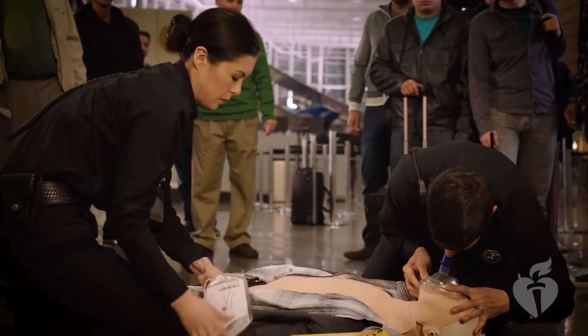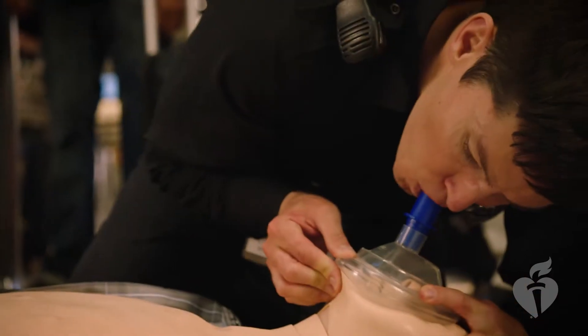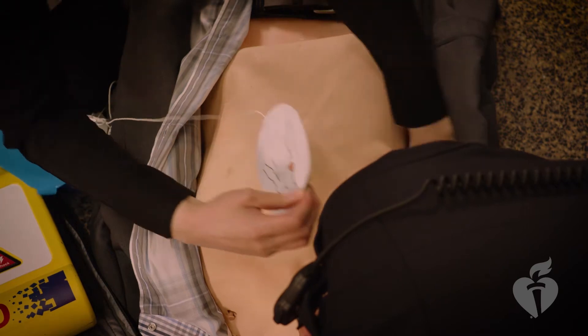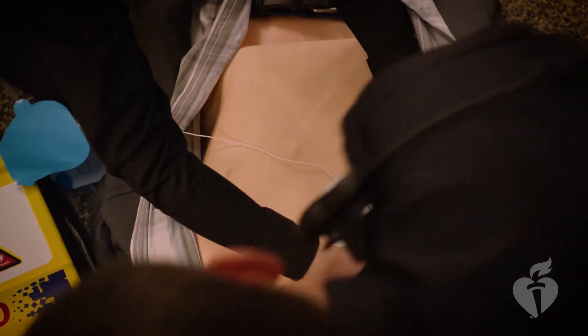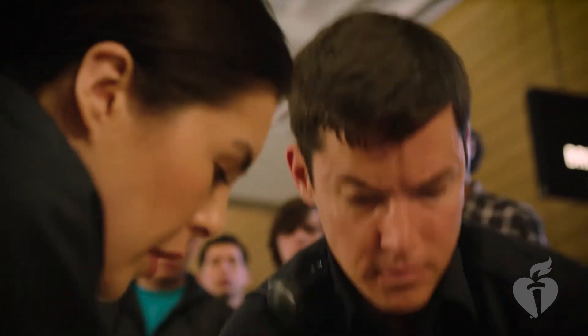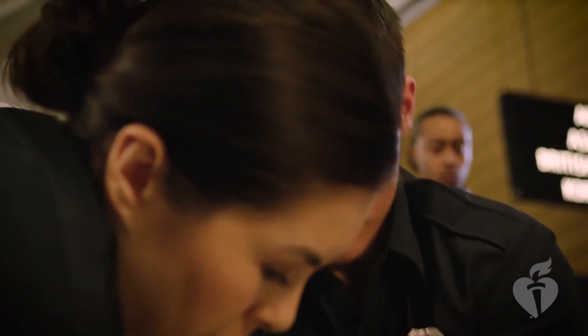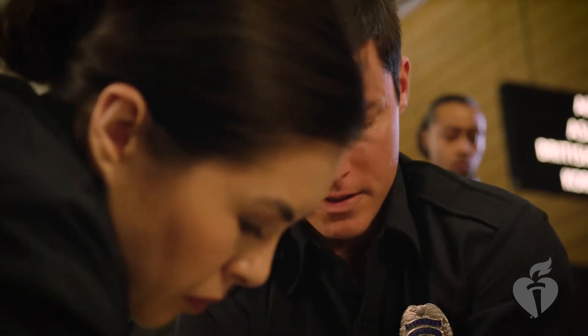Apply pads to the victim's bare chest. I'll attach the AED around your compressions.